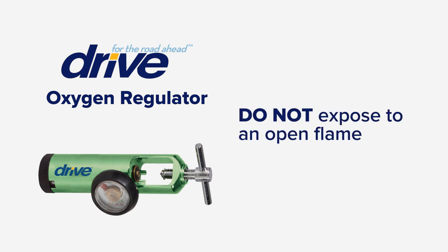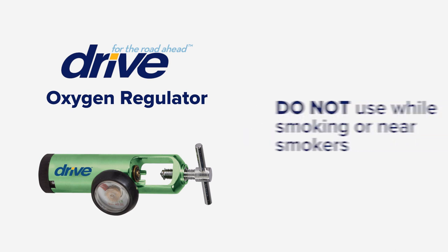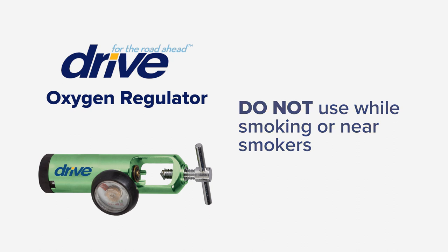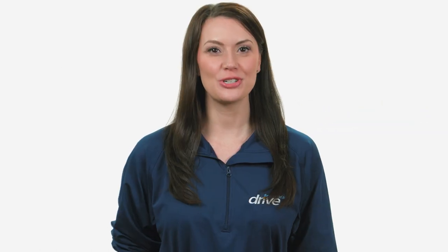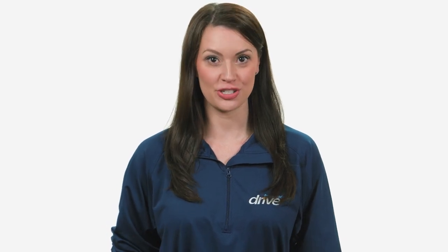It is important you maintain a safe environment for you and your loved ones. Do not expose to an open flame. Do not use while smoking or near smokers. And do not use oils anywhere on the unit. Please refer to your user manual for a full description of warnings, cautions, and directions for use.